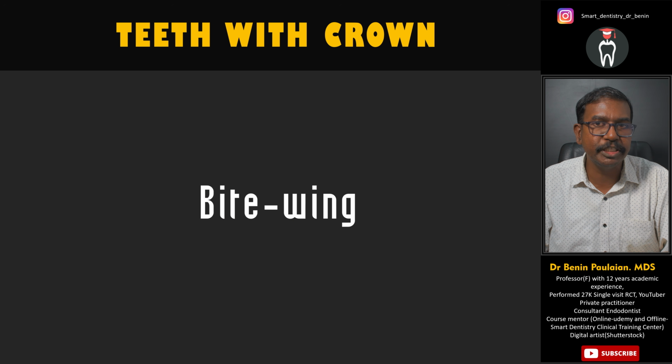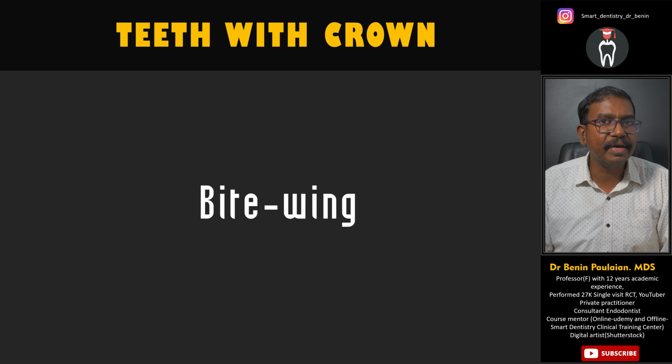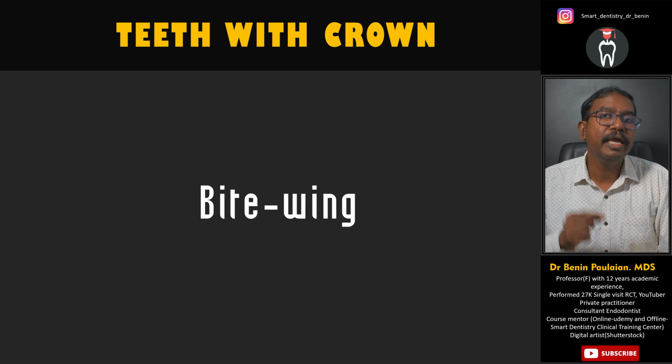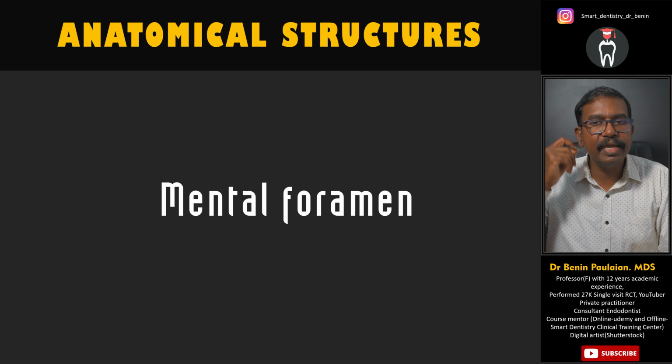So as I mentioned before, whenever there is a tooth with a crown, do not go for an IOPA, always go for a bite wing radiograph. It is going to be very, very helpful.